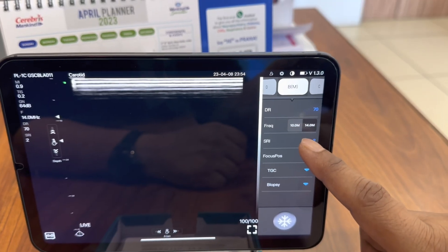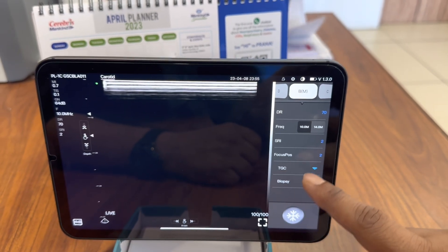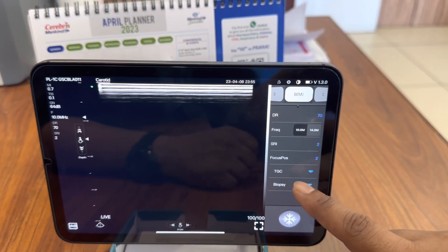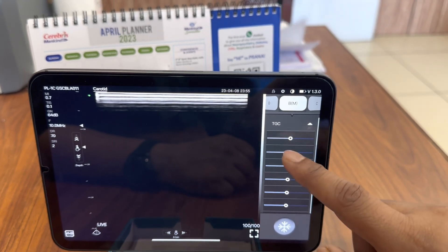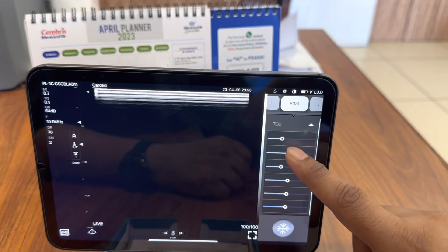Here you can change the frequency of the probe. It comes with two frequency ranges: 10 MHz and 14 MHz. This is the TGC mode. You can adjust the gain in the near field, mid field, and distant field.